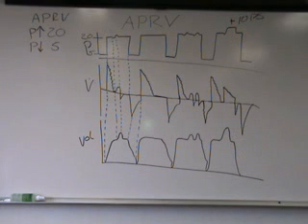So to classify this mode of ventilation gets kind of messy. You can say that the P high time is time triggered. The P high time is therefore time cycled. But you've got to be careful when you start talking about these as breaths, because we also have breaths that are occurring on the P high and the P low time. So I guess you could say airway pressure release ventilation is time triggered into P high and time cycled into P low.